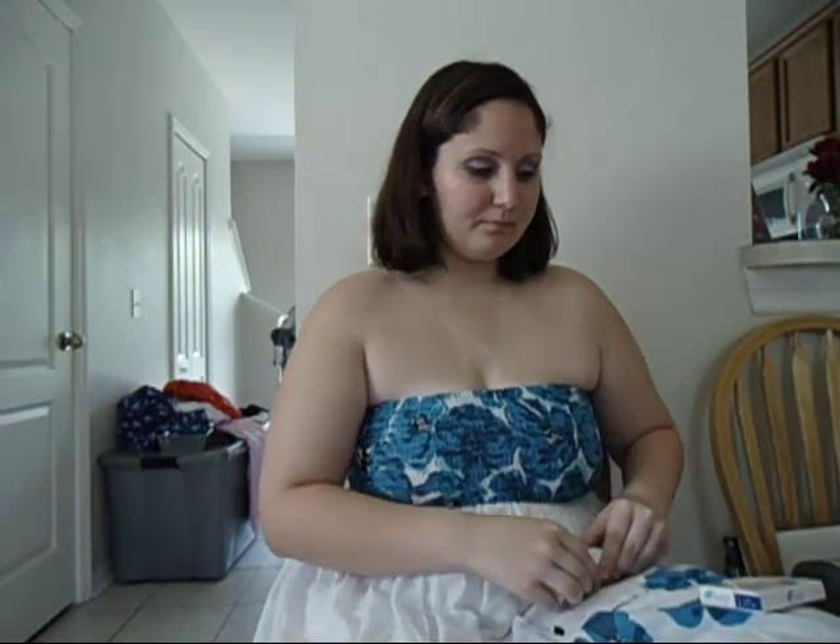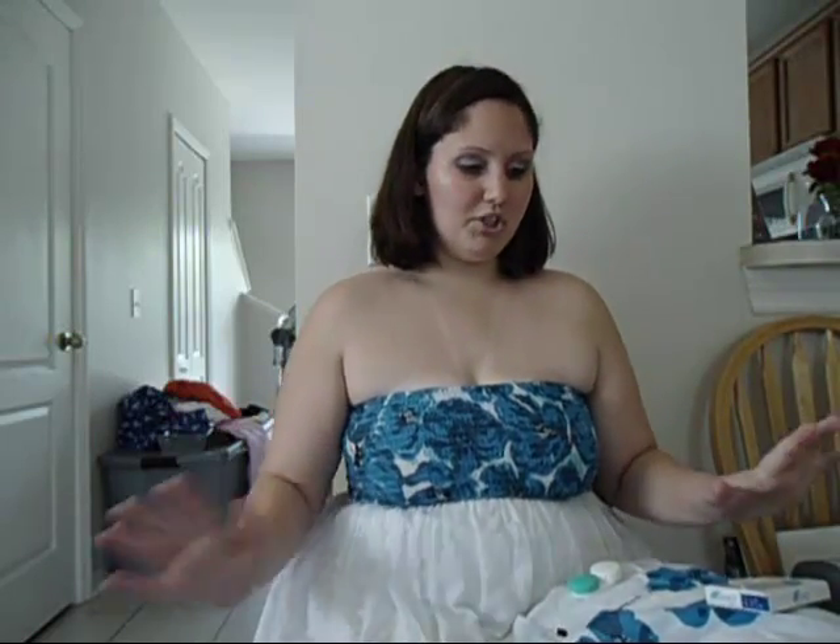What you want to do is, before you even touch your eyes or your contacts, you want to wash your hands with soap and water.